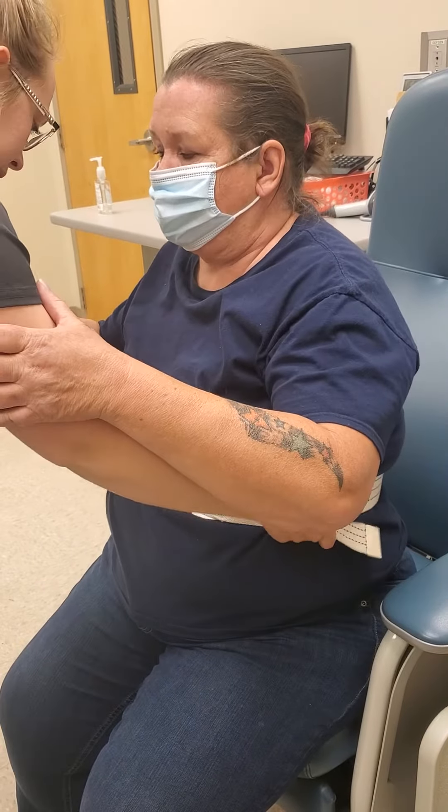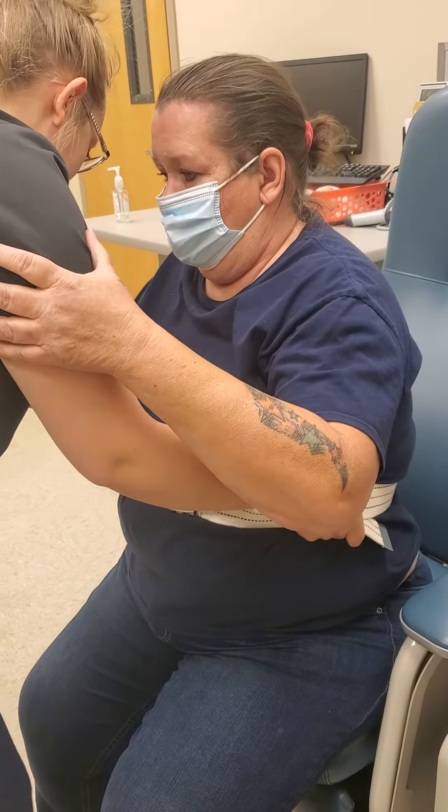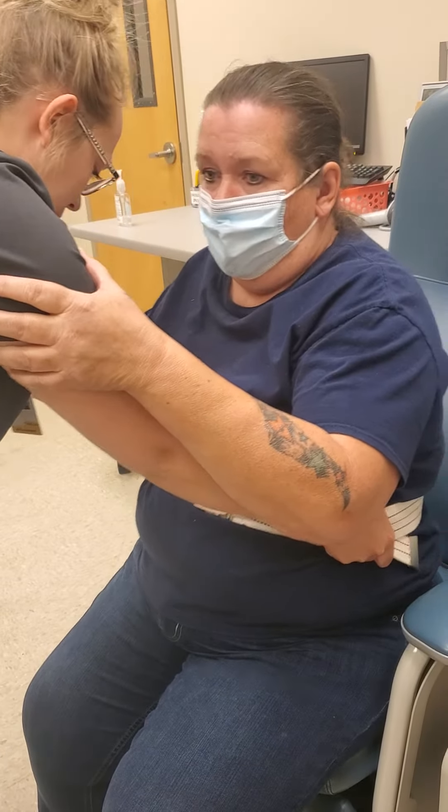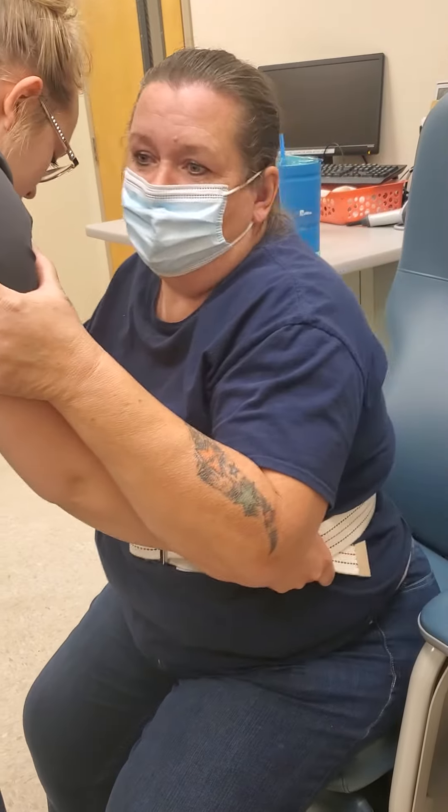I'm going to have you look forward. I'm going to place my hands right here. I'm going to rock you back and forth, and on the count of three I'm going to have you stand up. One, two, three.